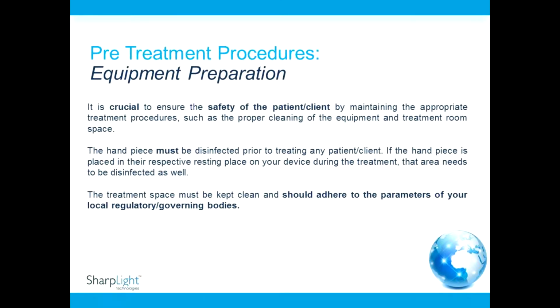It is crucial to ensure the safety of the patient or client by maintaining the appropriate treatment procedures, such as the proper cleaning of the equipment and treatment room space. The handpiece must be disinfected prior to treating any patient or client. If the handpiece is placed in their respective resting place on your device during the treatment, that area needs to be disinfected as well. The treatment space must be kept clean and should adhere to the parameters of your local regulatory or governing bodies.